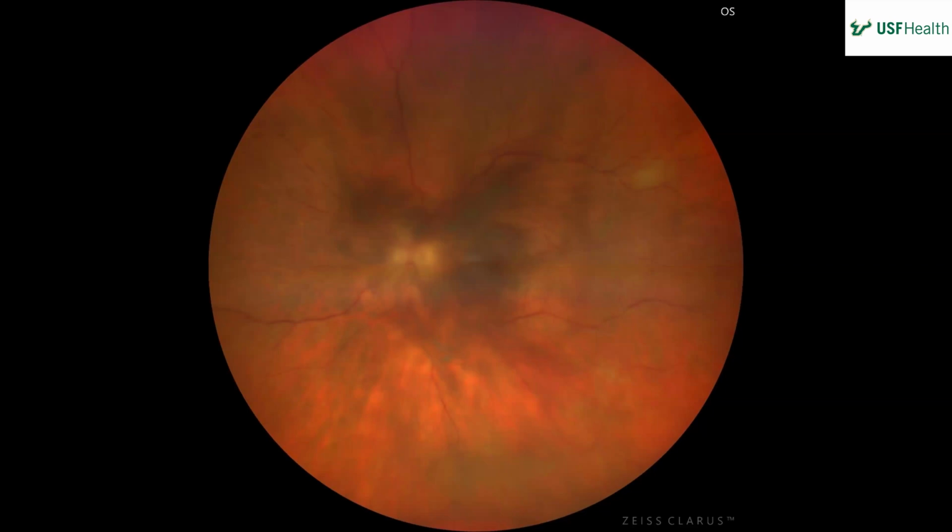Yeah, maybe something in the macula, like a little spot of hyperpigmentation. I don't know. How about supratemporal? It looks like there might be something in the retina. It's kind of white. Yes, at the very end of the superior. Okay, yeah. So one small creamier white area compared to the rest of the fundus, that you're circling there where the vessel splits.